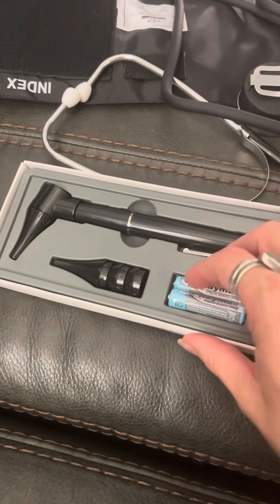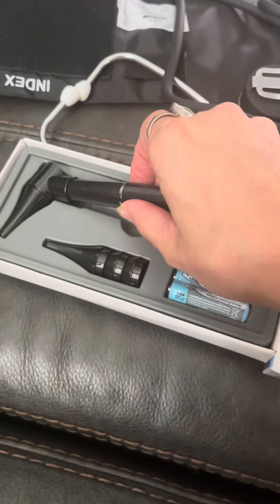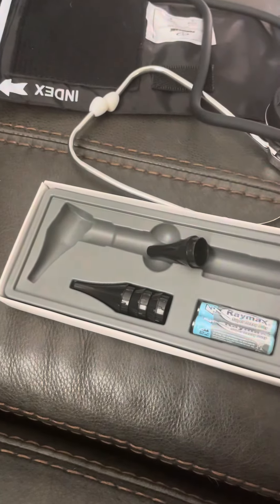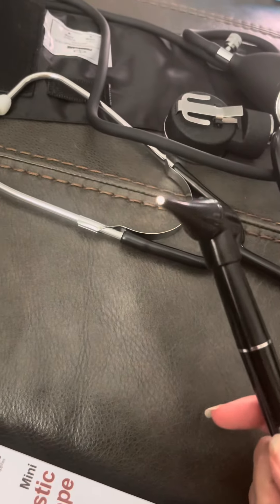Then we've got the otoscope. It comes with two batteries and three extra tips. You just push this to get that light.